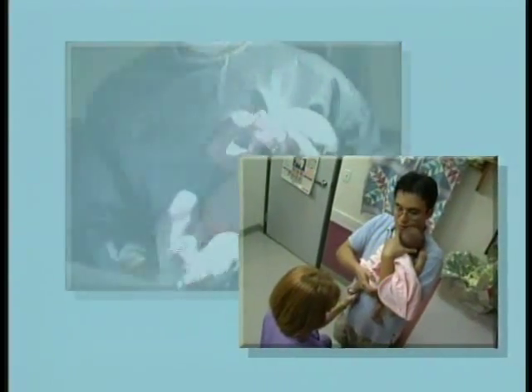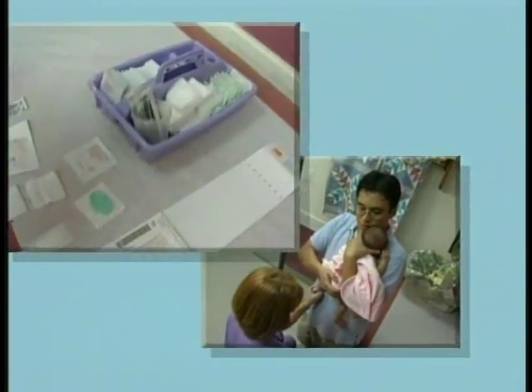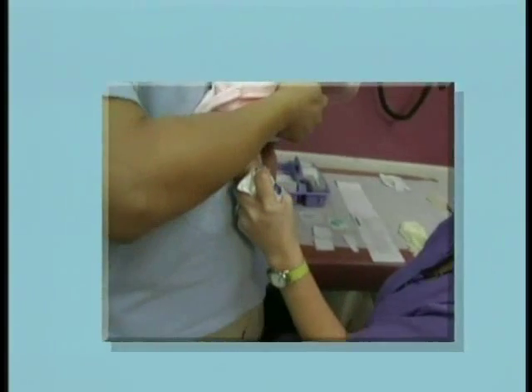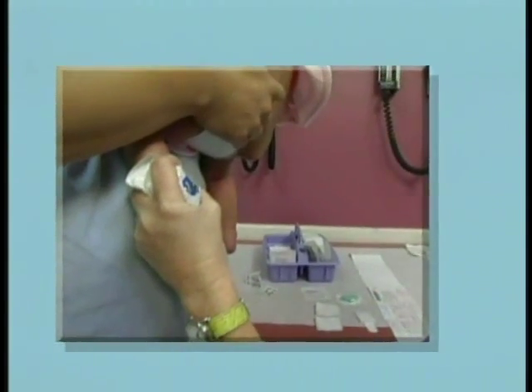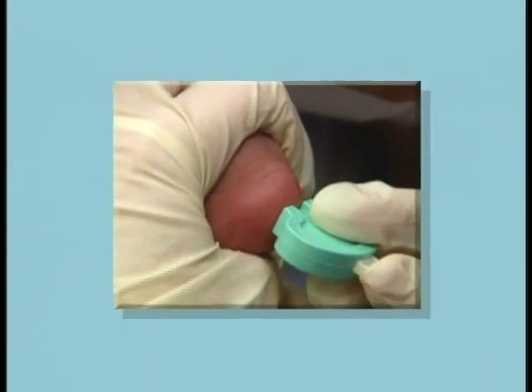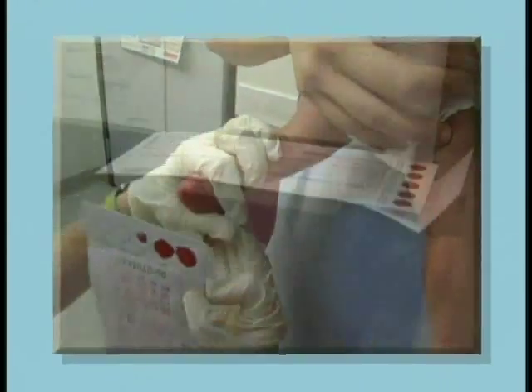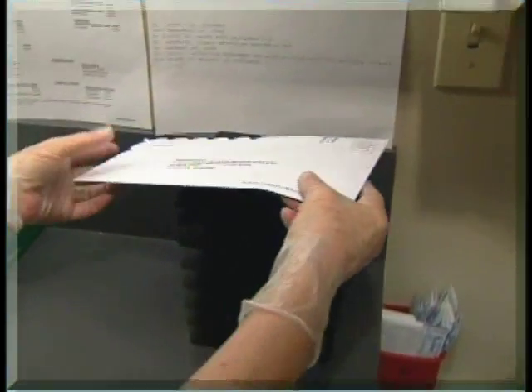Accuracy and timeliness are essential in screening newborns for 27 disorders as required by the state of Texas. This video demonstrates the elements of screening, at what times to do the screenings, the specialized supplies you need to use, completion of the required demographic data on the collection form, how to perform an appropriate heel stick and collection of the blood sample, and how to dry and mail the collection form.